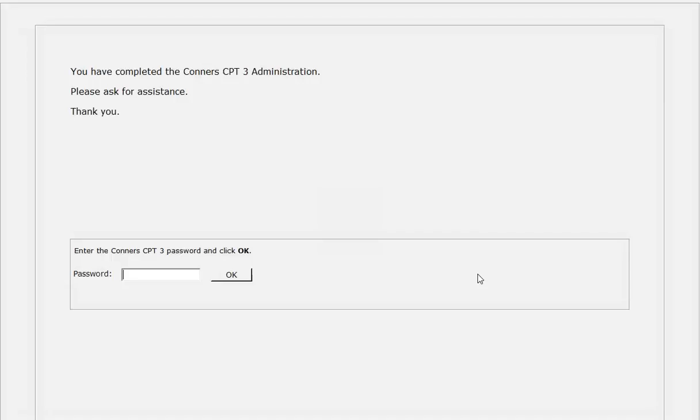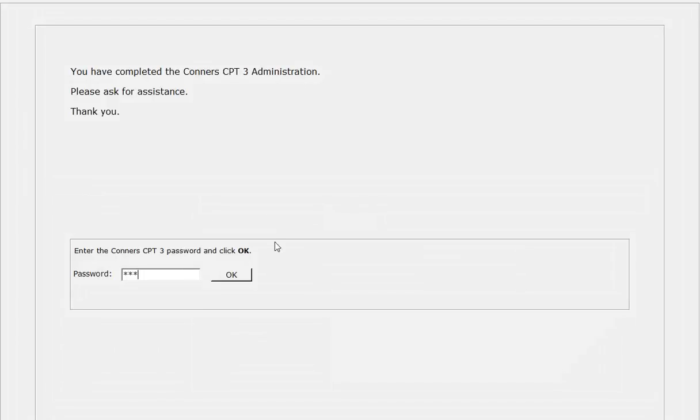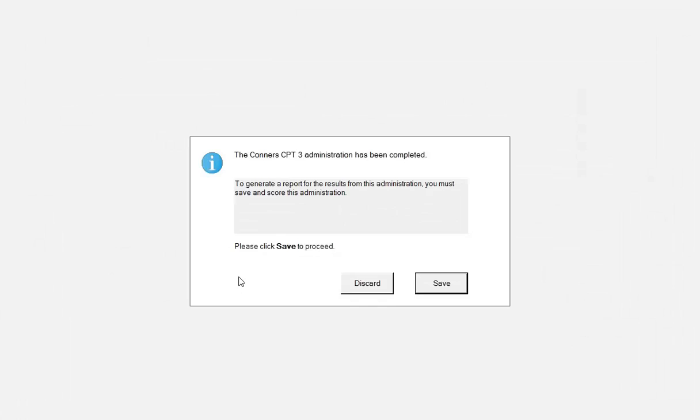Once the administration is completed, the program advises the respondent that they have completed the assessment and to please ask for assistance. The administrator then enters a password to proceed back to the Connors CPT-3 software main menu. At this point, you would choose to either discard or save the assessment that has just been completed.